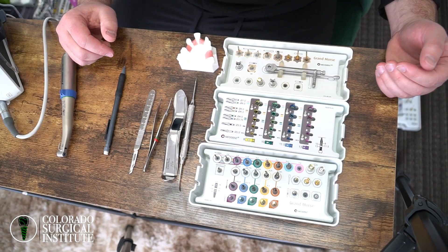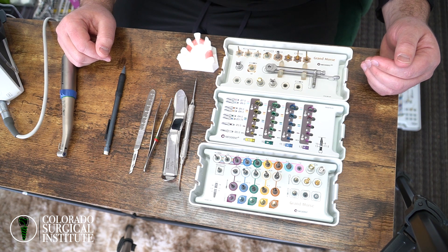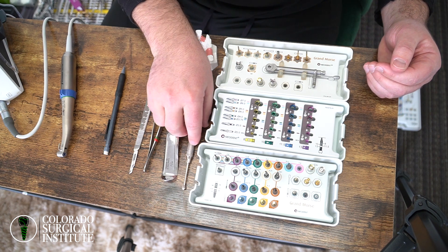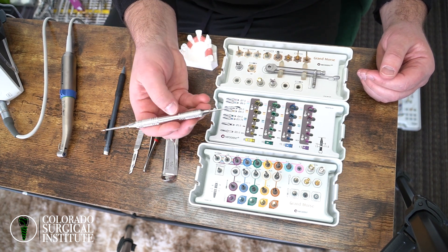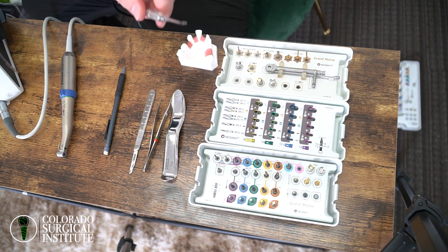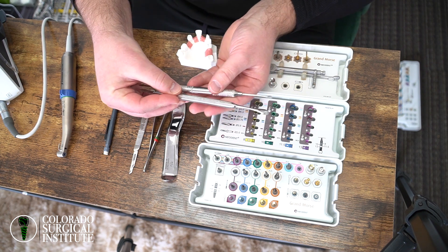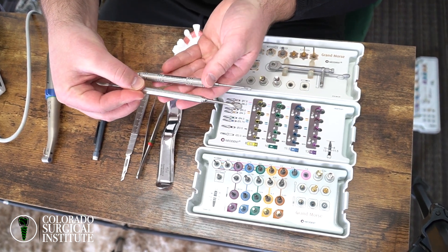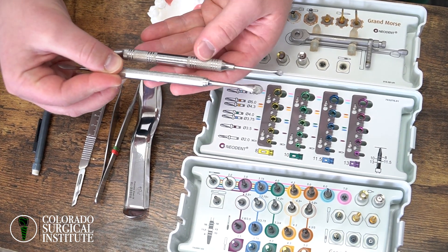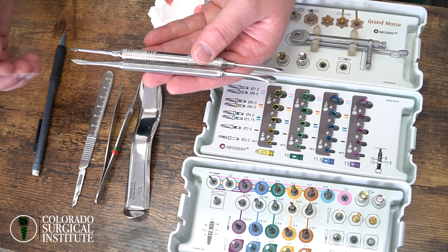Let's go over incision design and some of the instrumentation right before we're about to place the implant. One of my favorite instruments is this elevator — it's called a Boozer elevator. Even comparing it to a different type of periosteal, look how small this one is compared to the other. When you start using a smaller periosteal, specifically this Boozer elevator, your surgeries are going to get that much more detailed.